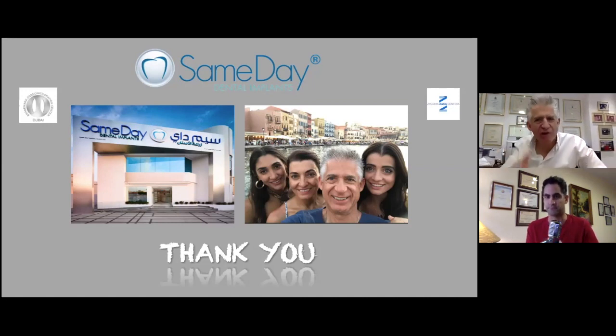Absolutely. Follow the protocol. If there's one important message, it is follow the protocol. And of course, we can't all remember the protocols. Yes. Go to the Versah website, and you'll find all the protocols. And you'll also find which drills you must use for the implant that you're using today. And you must follow those guidelines. Because if you just say, I'm going to go 2, 2.3, 2.5, 3, 3.3, 3.5, it's not going to work.